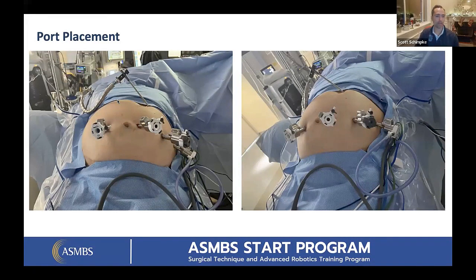I don't for a bypass. I do for a duodenal switch. I use an assistant port. But for the bypass, I put everything in at the beginning of the case. Essentially all the needles, I put a Raytec in. Everything I need is in at the beginning. So unless something really went wrong and you need an extra suction or something like that, there is really no need for an assistant port from my point of view. But I'm sure there are some people out there that use assistant ports for bypasses.